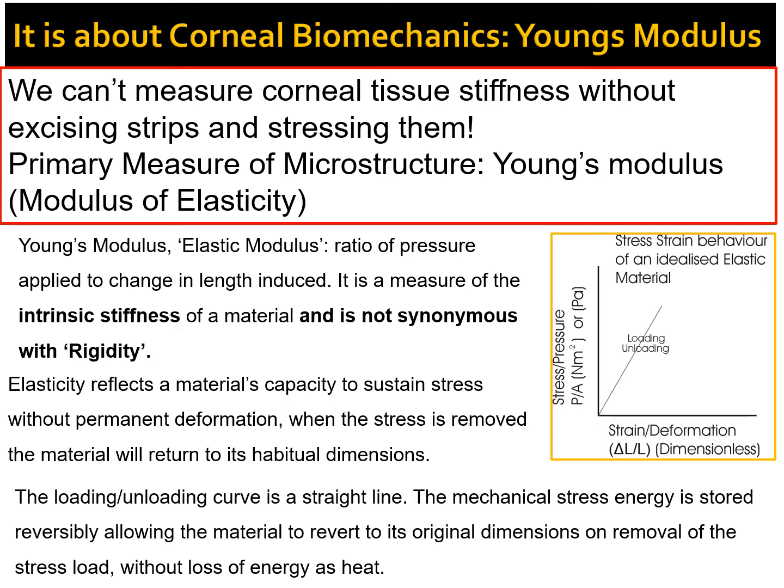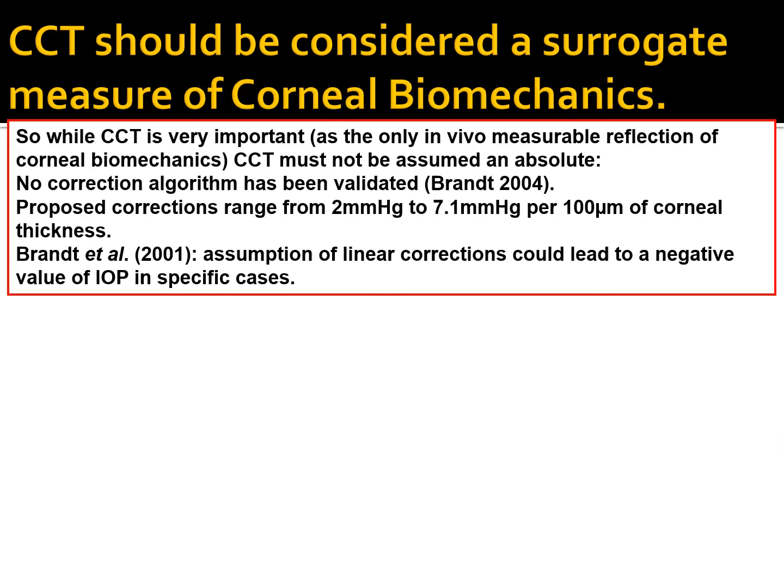So elasticity reflects a material's capacity to sustain stress without permanent deformation. And when the stress is removed, the material will return to its habitual dimensions. So the loading-unloading curve is a straight line. And the mechanical stress energy is stored reversibly, allowing the material to revert to its original dimensions on removal of the stress, without loss of any energy as heat. So that's the modulus of elasticity, or Young's modulus.